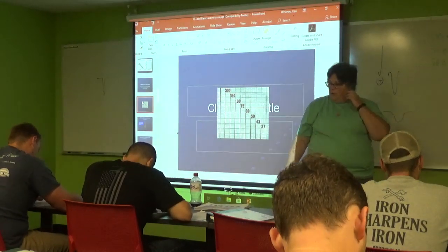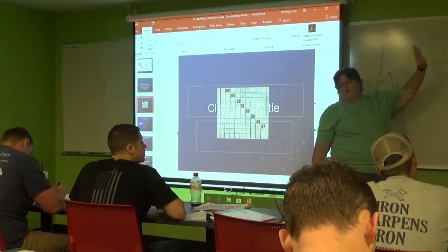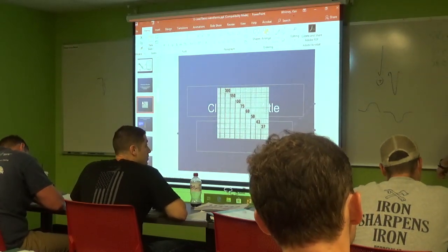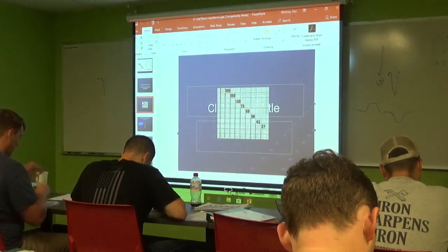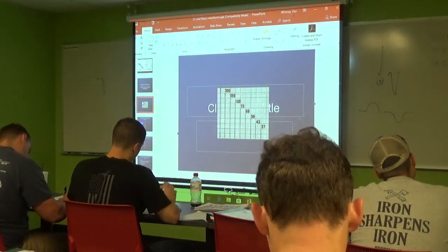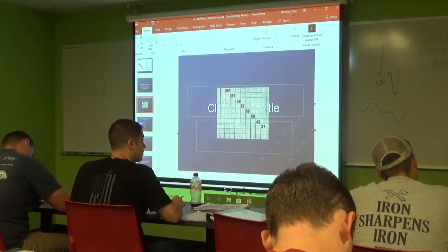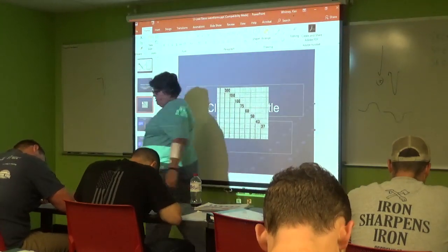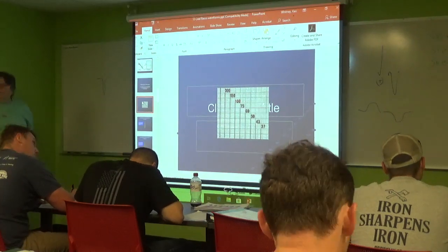Now go through the ones you've already done and look at your intervals. If you have a normal PRI, a normal QRS, and a normal QTC, then you write normal intervals right after. If you have a prolonged QTC, you put prolonged QTC at 568. Whatever's out of whack, you write in your interpretation after your original words. I'm trying to teach you how to write at the same time as read, so it goes on your run report.